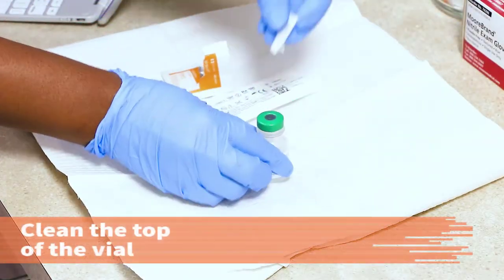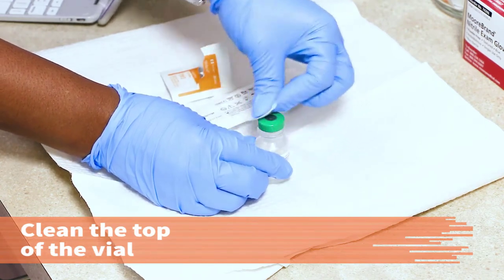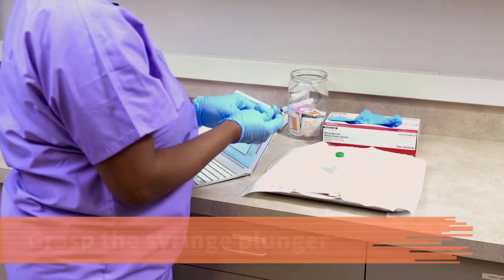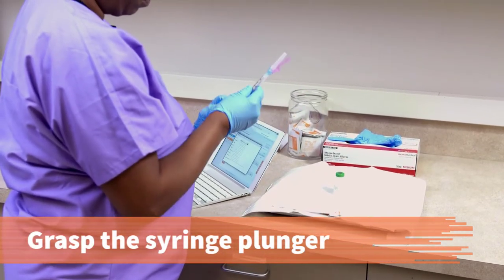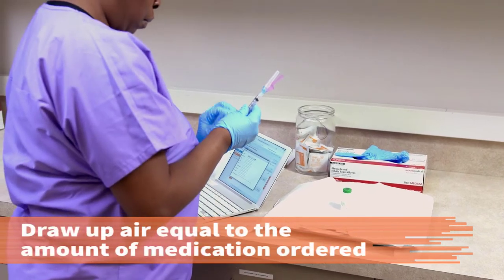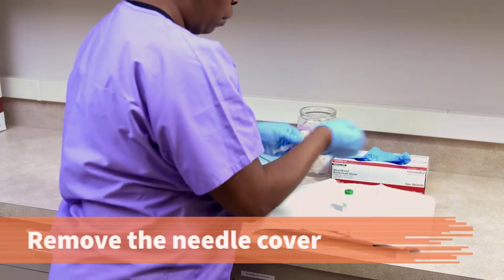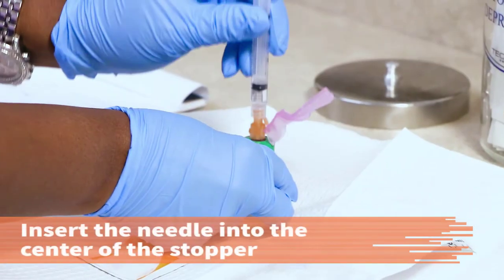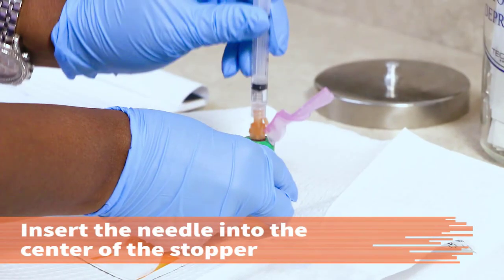Clean the top of the vial with the alcohol wipe using a circular motion. Place the vial on a flat surface. With the needle cover in place, grasp the syringe plunger and draw up an amount of air equal to the amount of medication ordered. Remove the needle cover.